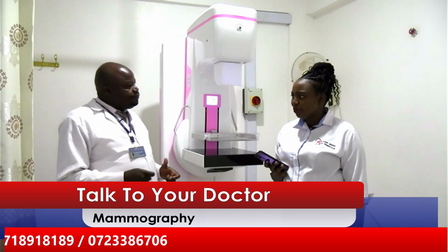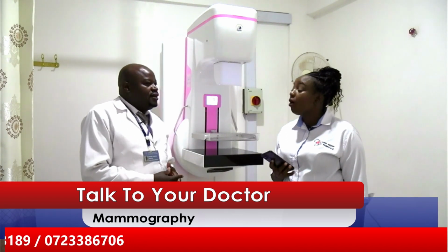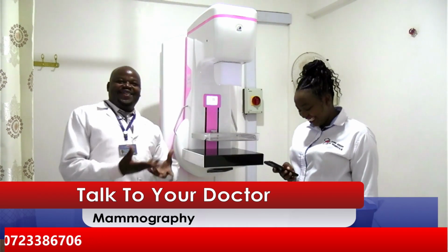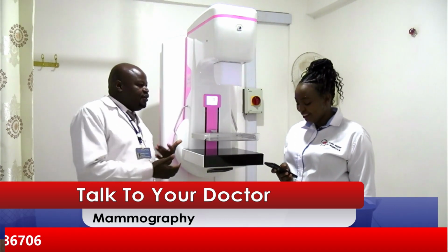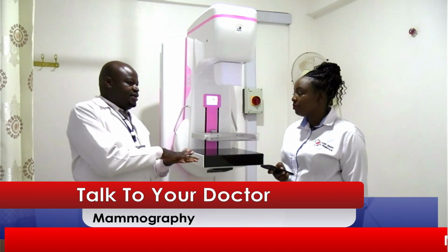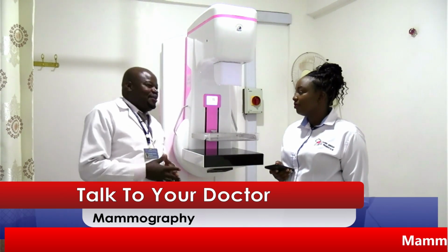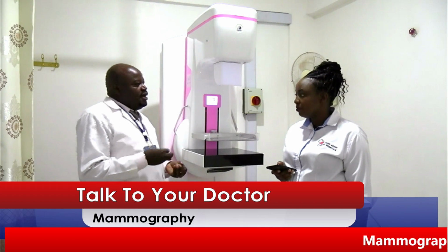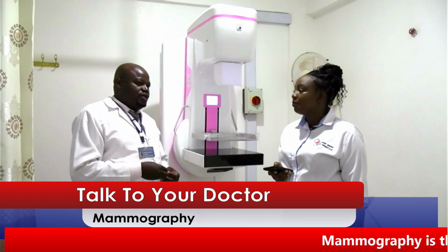So what is a breast implant? You know, there are those people who do some cosmetic work within their breasts. So if they do the cosmetic work in their breast, then of course they will be limited in performing the mammogram procedure. Remember, during the procedure we have to compress the breast. And when you're compressing and someone has put some implant inside, you know what will happen. And also, the images will not be okay. The images will give false positive information to our radiologist, whoever is reporting.